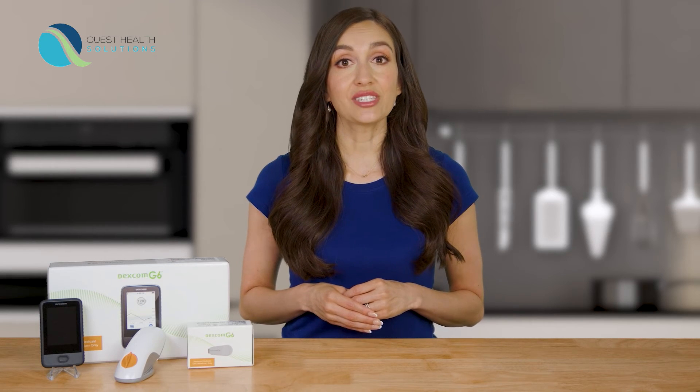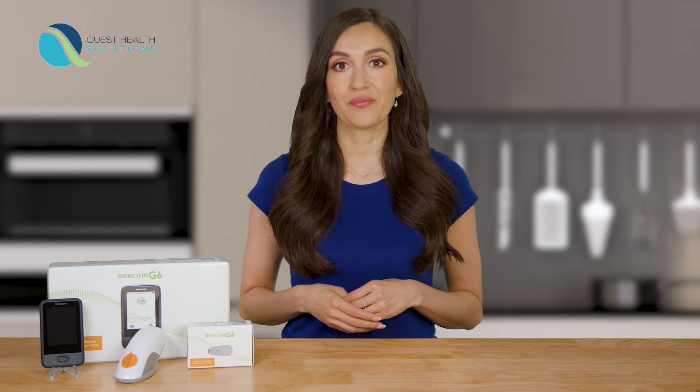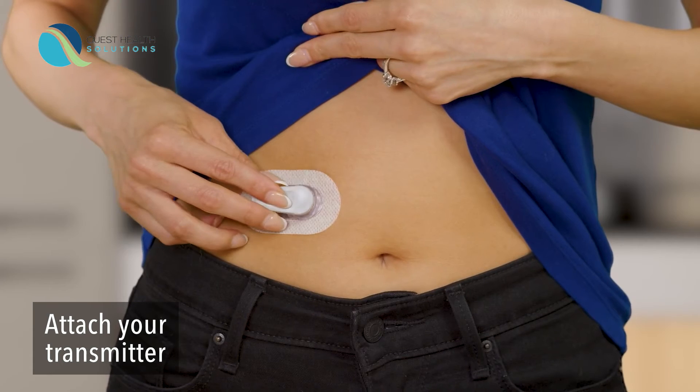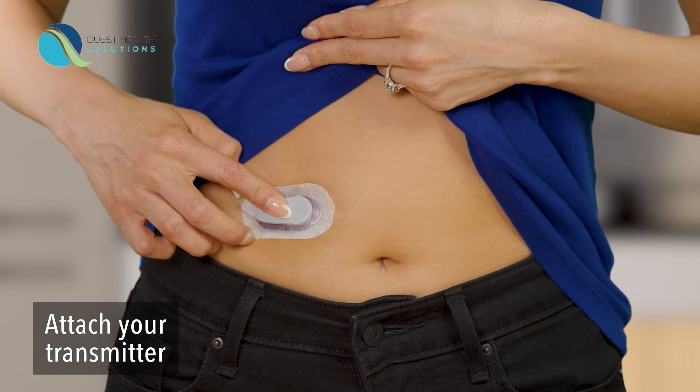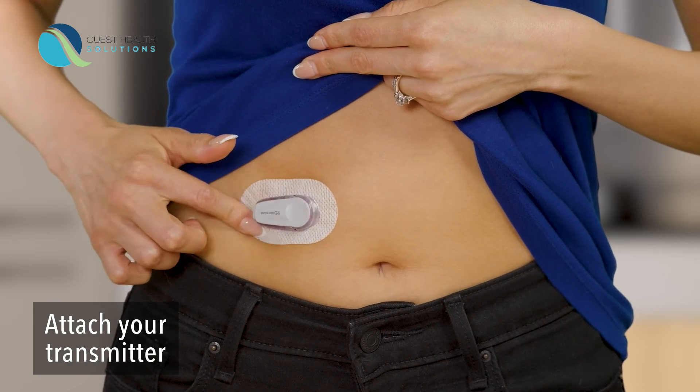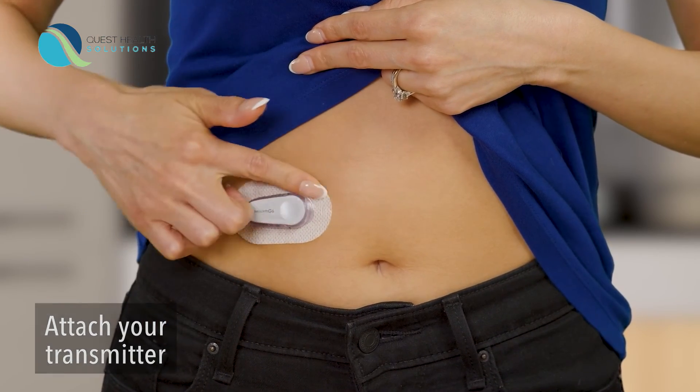You will wear each sensor for 10 days. Now it's time to attach your transmitter. Take your transmitter out of the box. Insert the tab of the transmitter into the slot on the transmitter holder. Snap the transmitter firmly into place. Rub around the patch 3 times. You've successfully attached your transmitter.